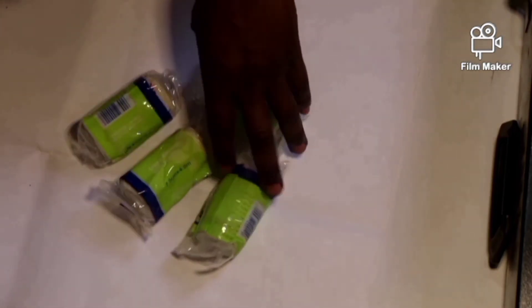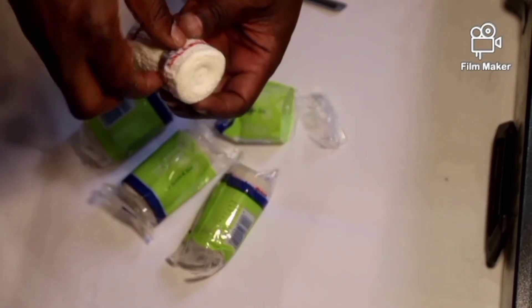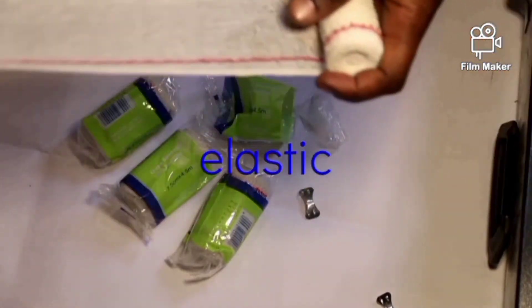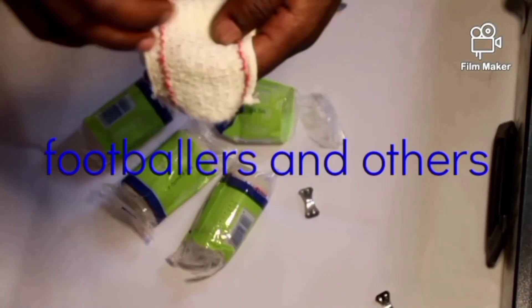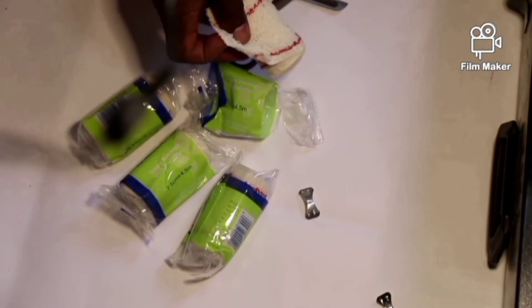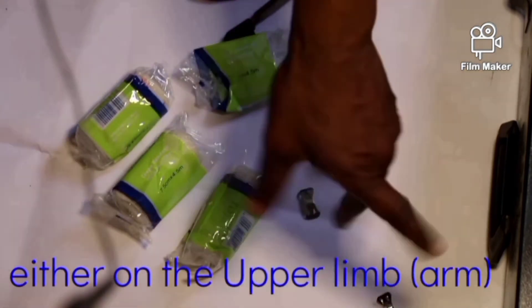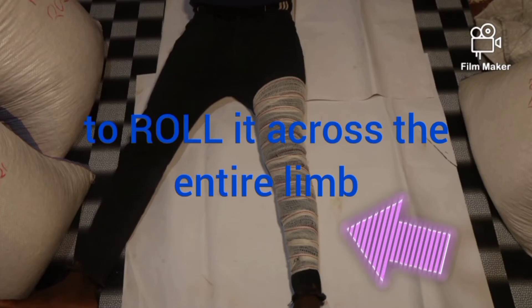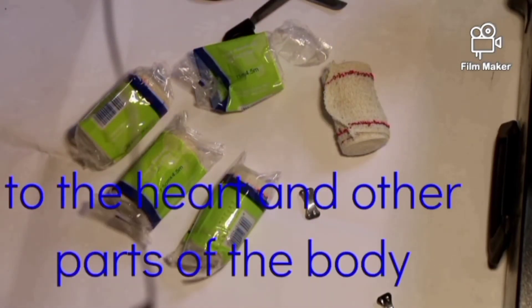These are crepe bandages. They come in a quantity of four. This is how a crepe bandage looks — as you can see, it is elastic. You are familiar with these because they are mostly used by sportsmen, footballers and others. In the first aid box, we use these elastic bandages when a patient has been bitten by a snake either on the upper limb or the lower limb. We roll it across the entire limb to slow down the movement of poison so it does not travel faster to the heart and other parts of the body.